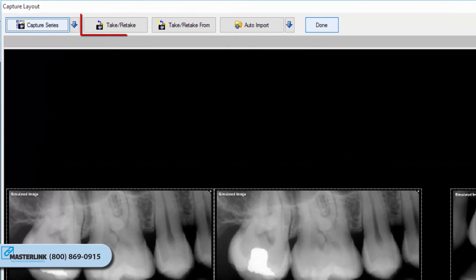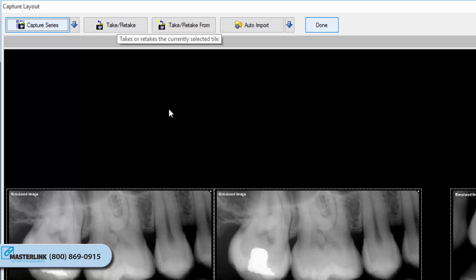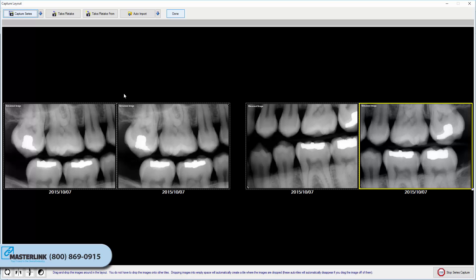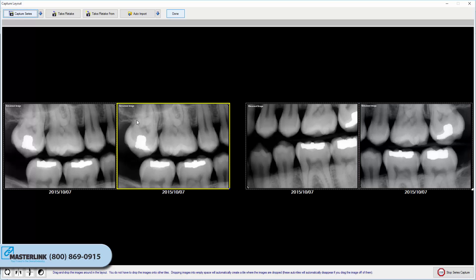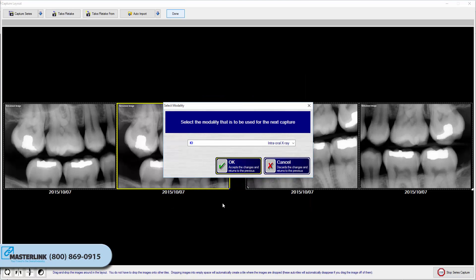The Take Retake button is used to capture an image for one specific tile in a layout. It is often used once a series capture has completed and there is a need to retake one or two images. Select the desired tile for capture and click the button. Again, if no preferred imaging extension is set for the layout, the user will be prompted to select an available imaging device based on the tile source.